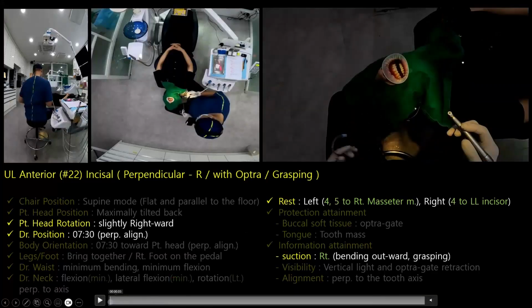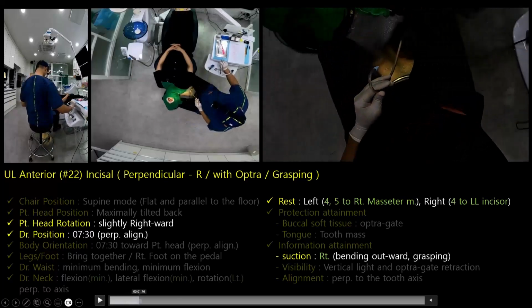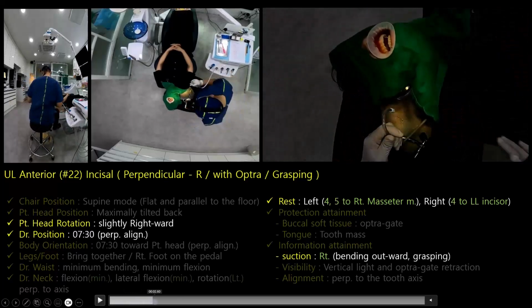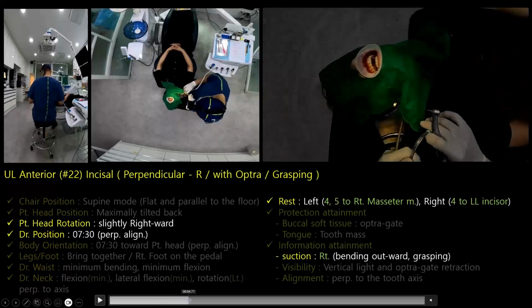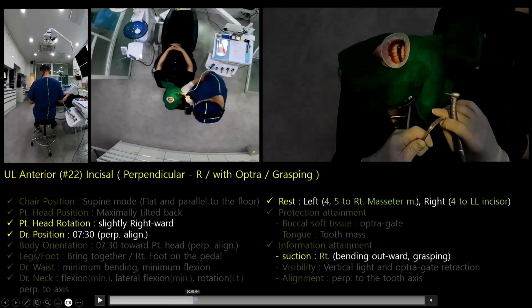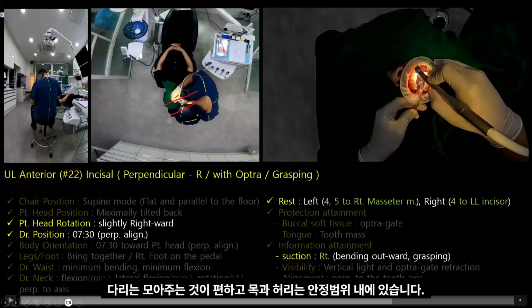One helpful tip before assuming the position is to push the doctor's table as far back as possible to ensure it doesn't obstruct you, and then to position yourself as close to the 6 o'clock direction as possible. It is more comfortable to keep your legs together, and your neck and lower back should not deviate significantly from a stable range.